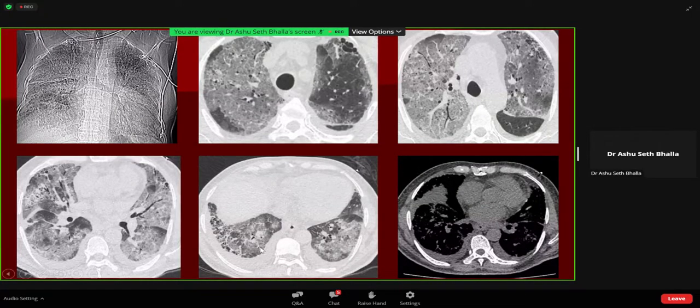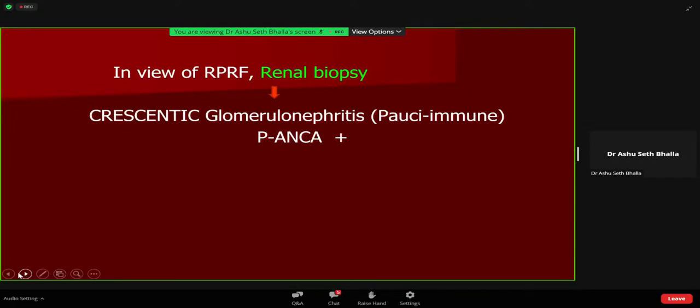So DAH versus an atypical infection, like viral pneumonia, that you could be dealing with. And if it doesn't turn out to be DAH or pneumonia, then the third is that you label it as an idiopathic acute interstitial pneumonia. Those were the DDs, but remember we have other manifestations.